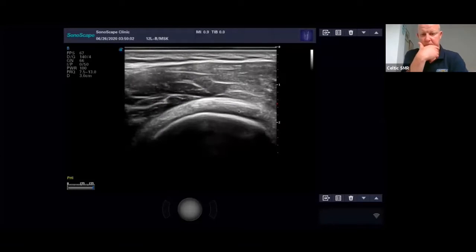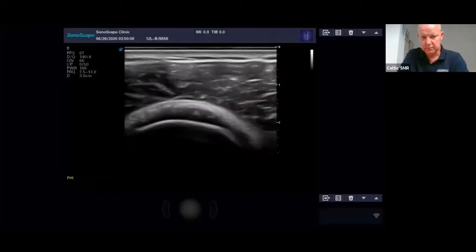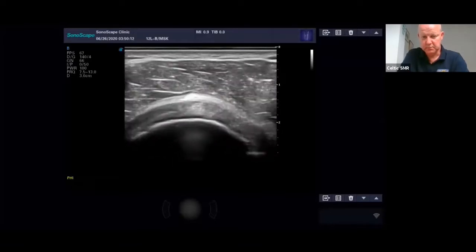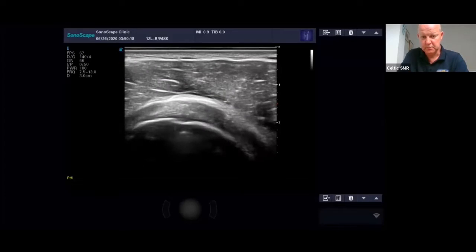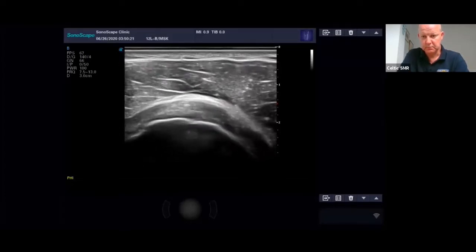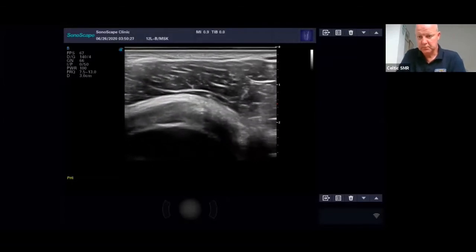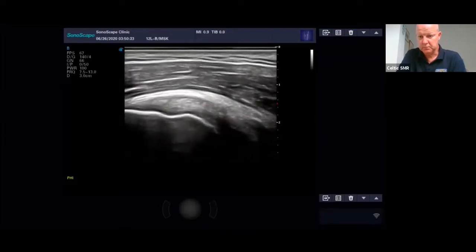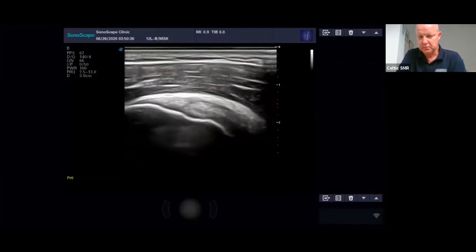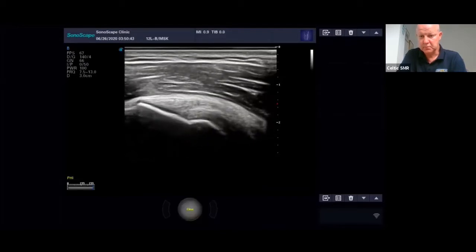Can you show them how it changes when you go from short axis into long axis, and how you keep the tendon in the picture? Yeah. If you're seeing the tendon nicely, you want to see a nice bony echogenicity, brightness to the bone. You can do it in one sweep, but it's probably better to hold the probe, so when you turn, you're turning on the same axis and not moving, because it's easy to move, especially with jelly on the patient. Then that's the long section where you see your tendon fibrillar pattern.